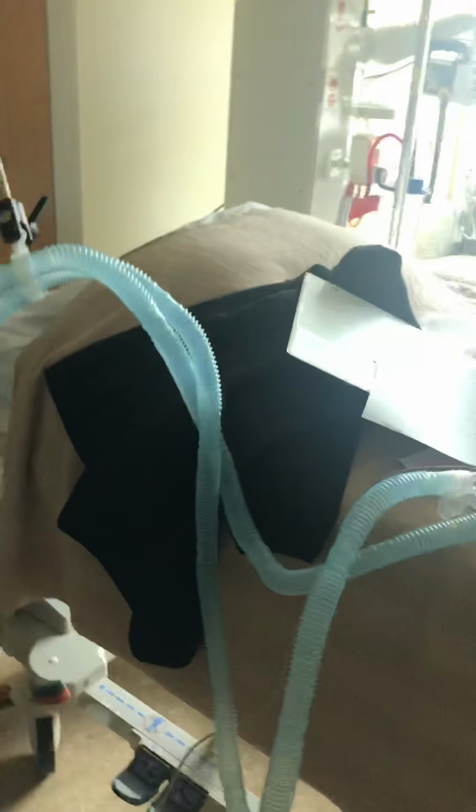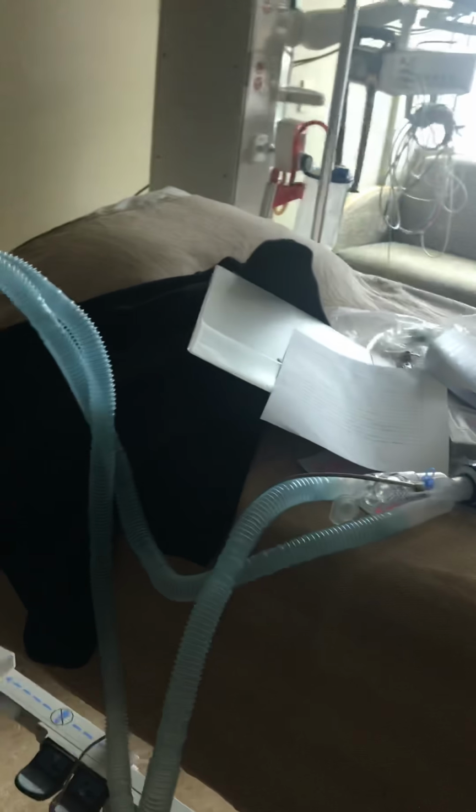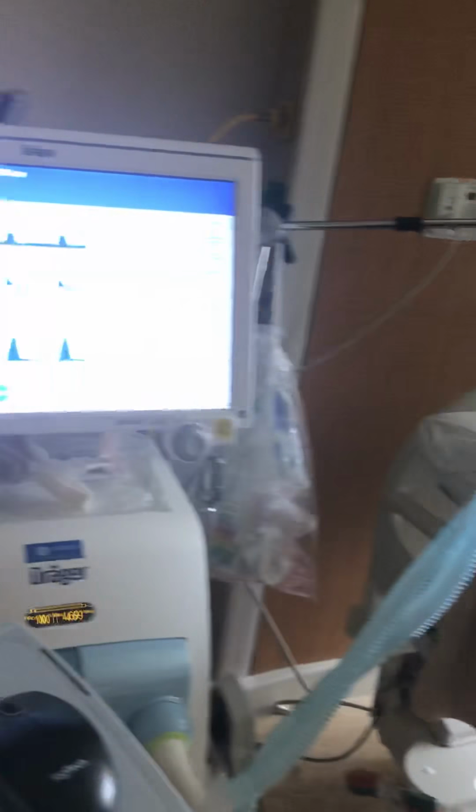So then our flow sheet automatically saves. Everything looks good, our patient is stable, and we are finished with our check, setup, suctioning, and med delivery.